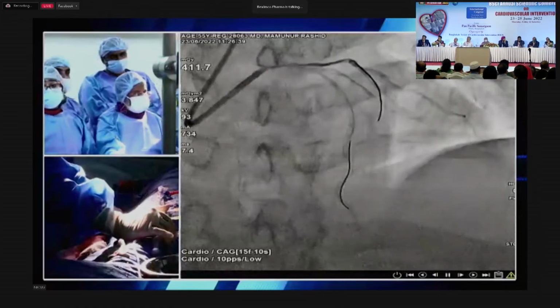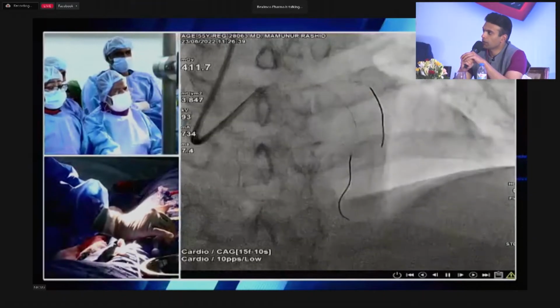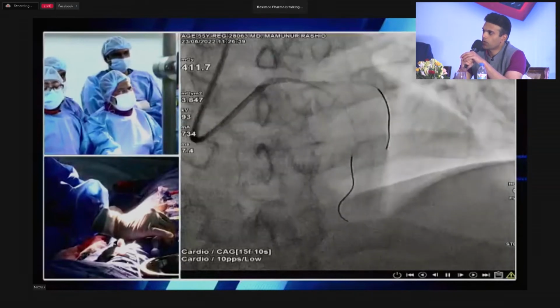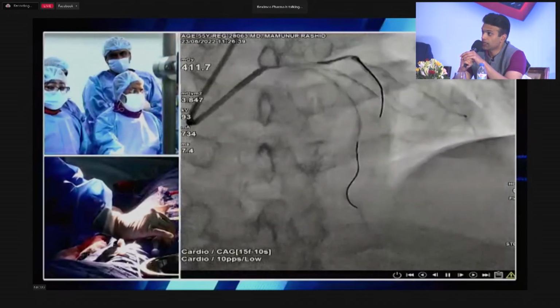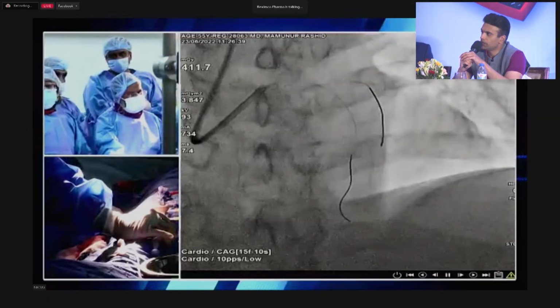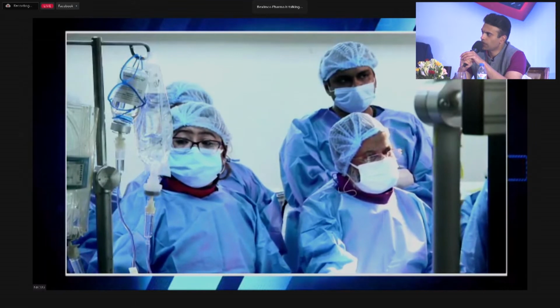The next question becomes, what are you going to do about your IVUS findings? There are areas with calcific plaque, but that calcific plaque, as you'll hear in a few minutes, doesn't require calcium modification, because it's only a single arc of calcium. That calcium is thick, there is no reverberations behind it. Notably, at the ostial LAD, there is a lot of dropout despite no calcium.